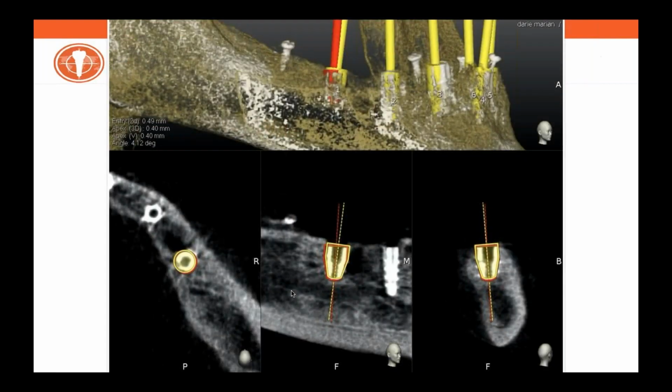And here I'm presenting you exactly with one picture. And the picture, again, I thank Dr. Luigi Vito Stefanelli for having lent this picture to me. I borrowed the picture from him, and the picture shows exactly what the endpoint of Evalunav is.